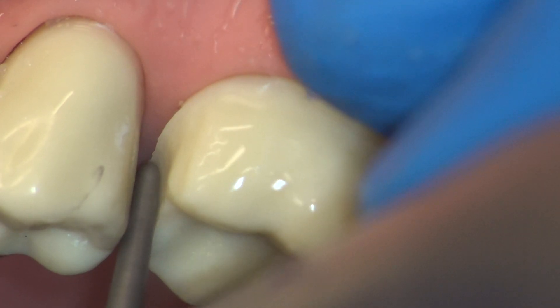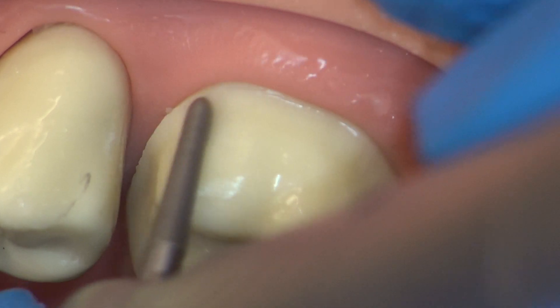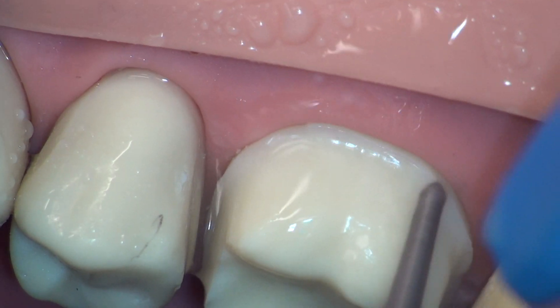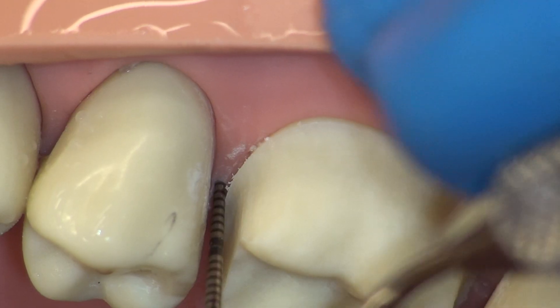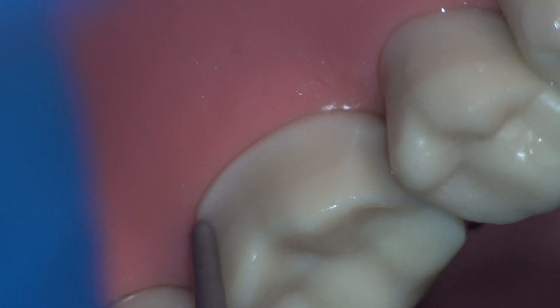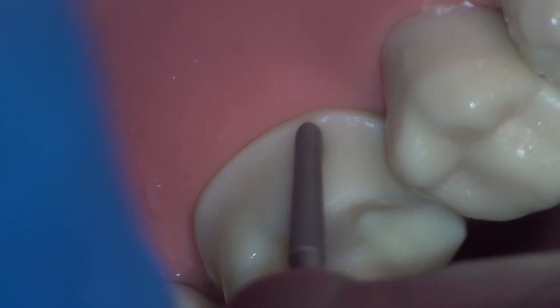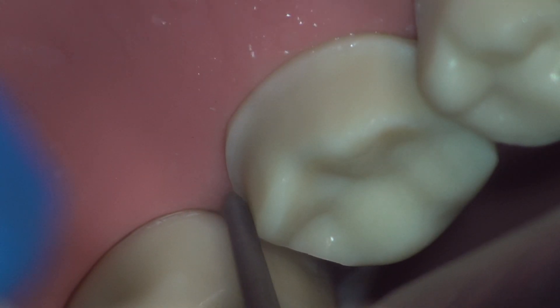Moving on to our direct buccal view, we begin refining the finish line circumferentially, proceeding methodically from one side of the tooth to the next. Note that each brush stroke of the burr overlaps with the previous and extends beyond. In this manner, we proceed across the entire finish line in a systematic way. Flake off any debris using a probe. For better visibility in the distal area, I work from lingual to buccal — the opposite direction. Work on each area in the direction that is most comfortable to you. We proceed to the lingual side in a similar overlapping manner, remembering to roll with the burr. Here in the mesiolingual area, we notice that the finish line is too far supragingival. There is a slight defect in the distal lingual area, which we can correct in the same way.